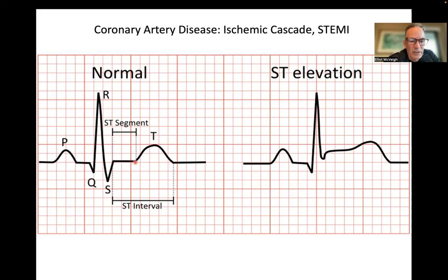So this usually comes back down to 0 net voltage, say on lead 1, when the heart is in that contracted condition. If, on the other hand, there's a big chunk of tissue that is abnormal and is not depolarizing properly, this may never come back down to 0. There could be this residual voltage between 2 chunks of the heart that causes this non-zero voltage here, and this is called ST elevation, because it's between the S complex and the T complex.